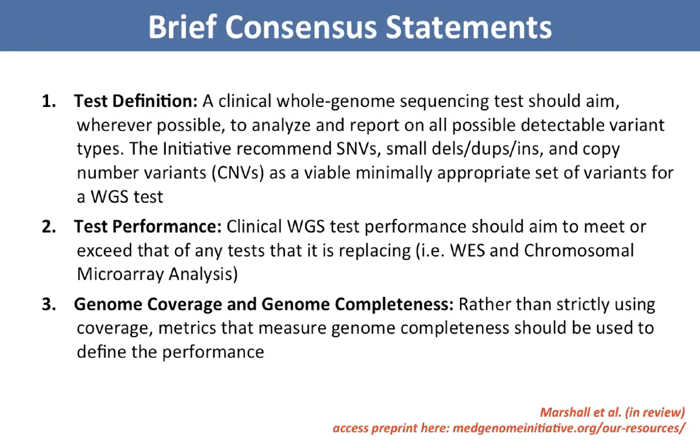Genome sequencing is a very powerful technique, but it's often difficult to validate variant types up to a clinical standard. At the very least, we recommended that individuals, when they validate a test, can report out on the small variants and also copy number variants. This was what we felt was viable as a minimal appropriate test.